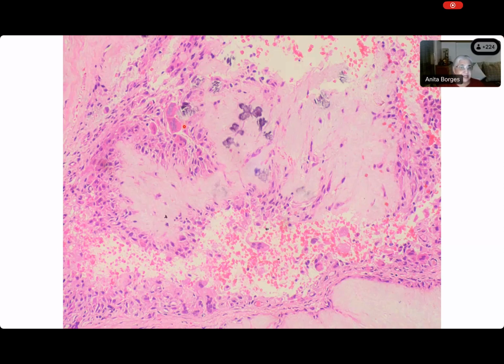These are histiocytic collections. They are histiocytes. Is that what you wanted to say, Prayas? Yes, ma'am. You raised your hand. So did you think that they were histiocytes, or did you think something else? What do you want to say? Mixed inflammatory cells.